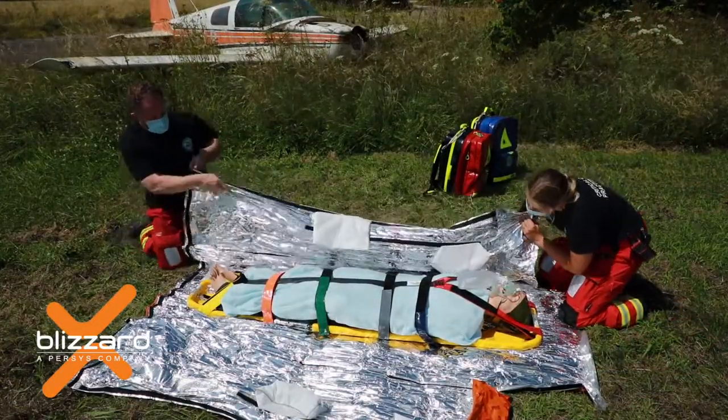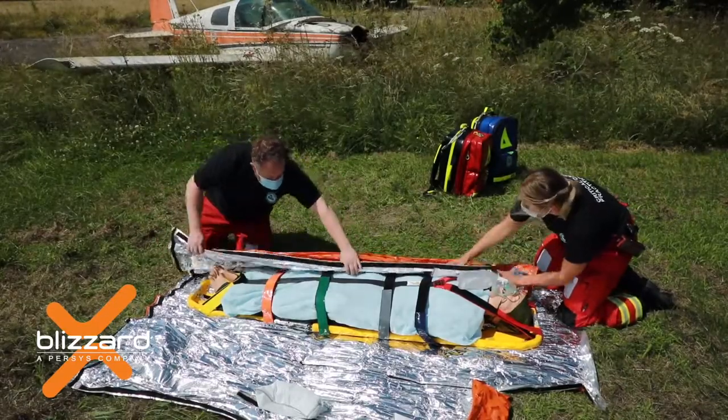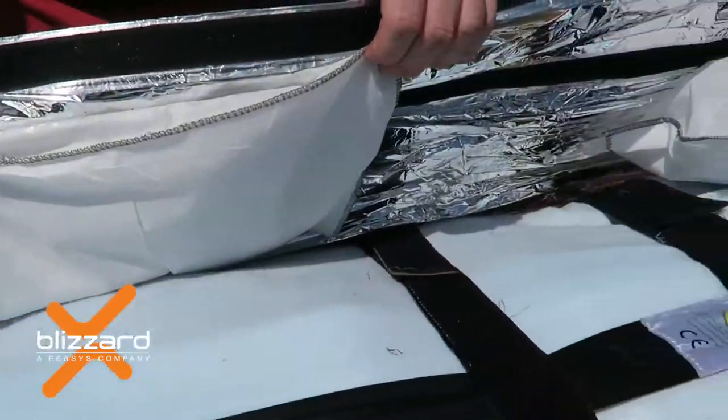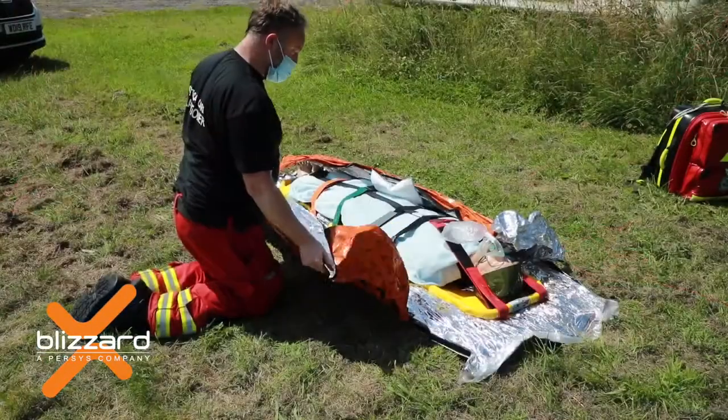Once the casualty is in the product, fold the side panels over onto the casualty's body, ensuring the heat pads lay on the chest and groin areas on both sides. Do not place the casualty on top of the heat pads at any time.